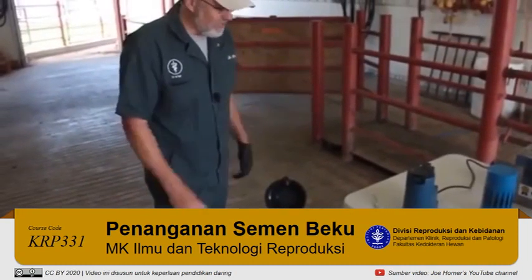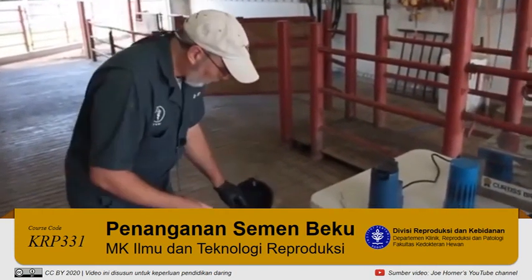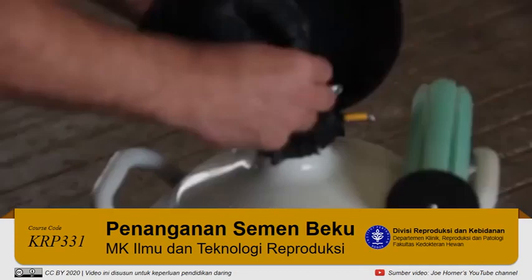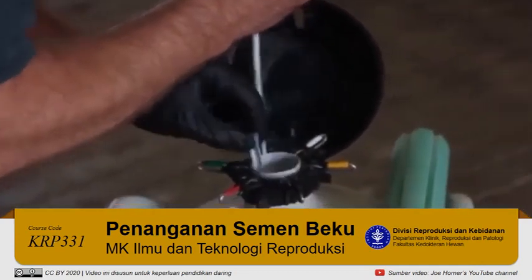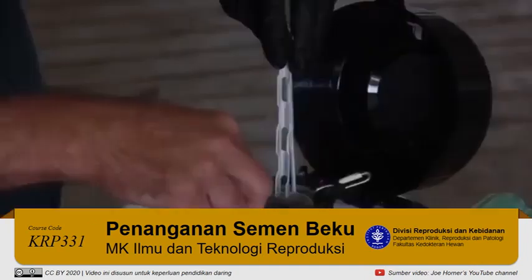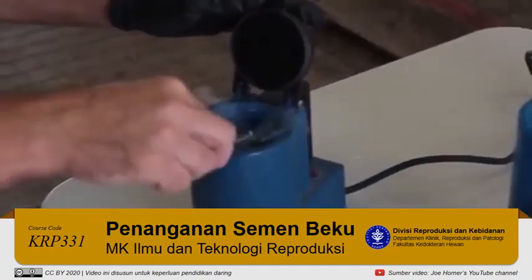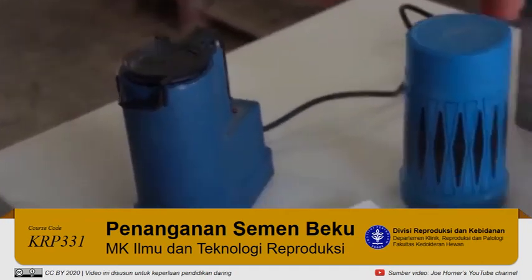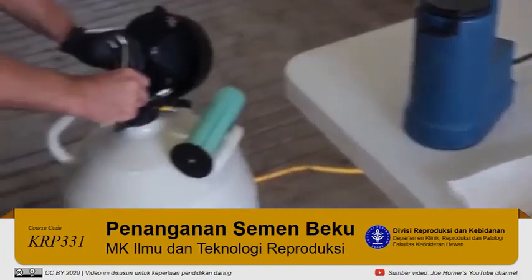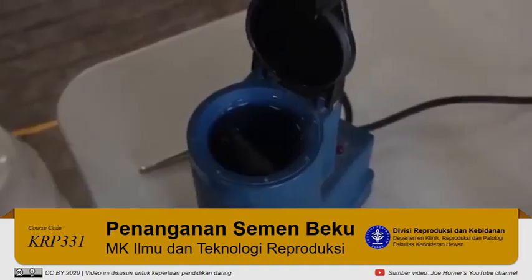For today's demonstration, I know the bull is in canister six. With multiple canes in there, I first bring up the canister just far enough to see and identify the cane I want. I grab that cane and pull it up to locate the unit of semen. I want to minimize the time the semen is up in the neck. Once I have the unit, I allow the canister to go back down, put the semen into the thaw bath, and start my timer for 45 seconds.